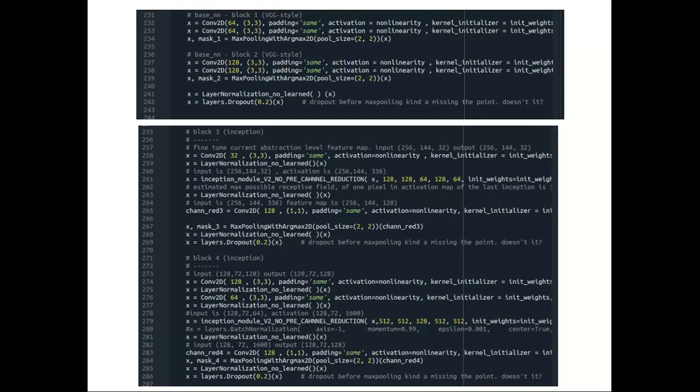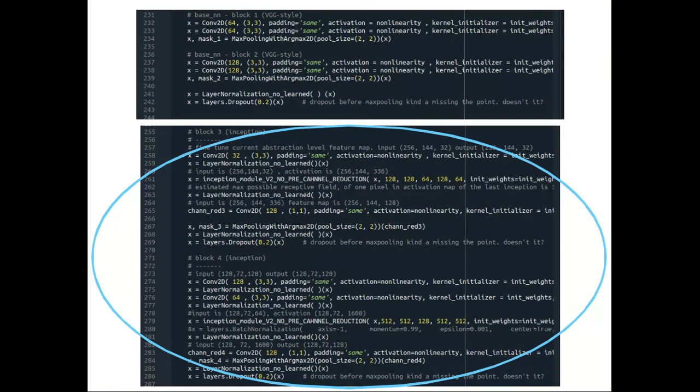Because of that, in the model's first two blocks, which are the first four convolutional layers, I put a simple VGG style stack of layers. The first few convolutional layers generally learn only very basic, small spatial structures, so there is no point in starting a complicated multi-scale computation unit so soon. We would be much better off here with a VGG-like starting point, as it has better reversibility. After this VGG-like opening of the model follow two inception blocks to give the model real multi-scale observation abilities.